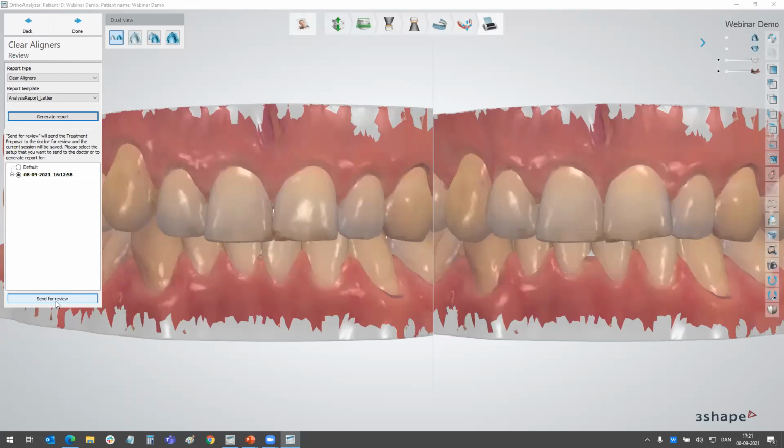Yeah, but the Ortho System Premium guys will get the ClearAligner automatically as part of the package. There's a question here if I can name all the paid functionality again.